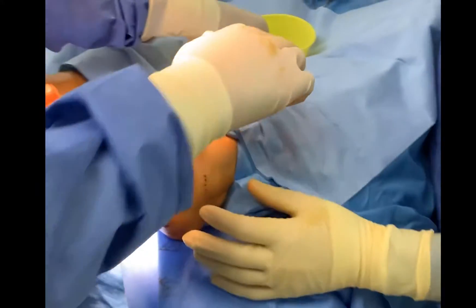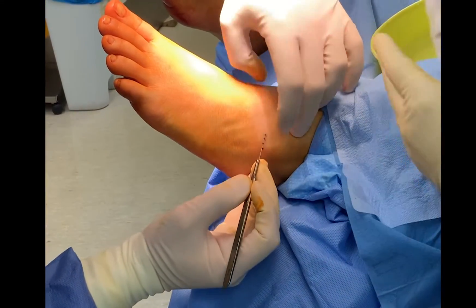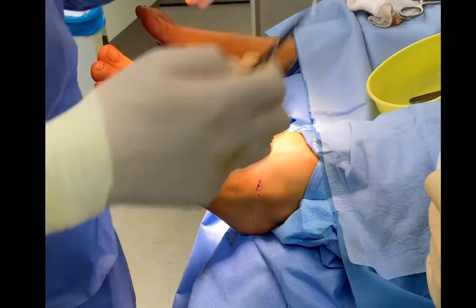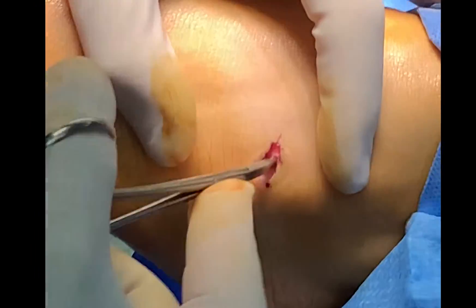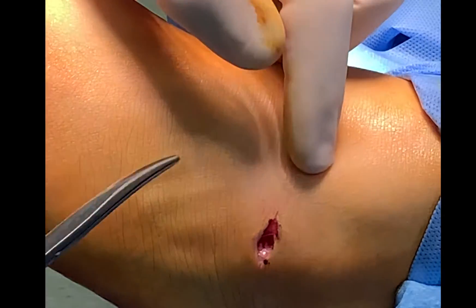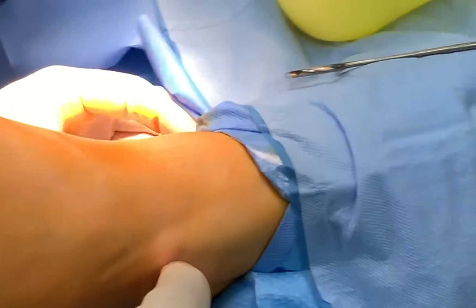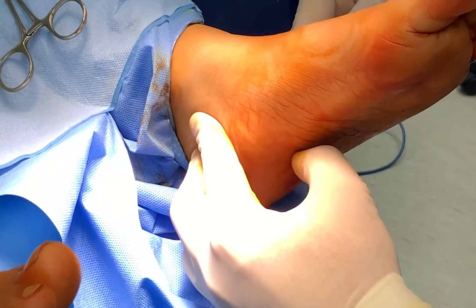We're going to make a small incision over the sinus tarsi. There's no tourniquet so we'll see a little bit of bleeding, but it shouldn't be too much. Once through the skin, we go through the subcutaneous tissue and spread that aside. Then we release the interosseous ligament that connects the talus and the calcaneus. We've got the guide wire — we insert that in. You can see it coming medially, just above the sustentaculum tali. The interosseous ligament is being disrupted.